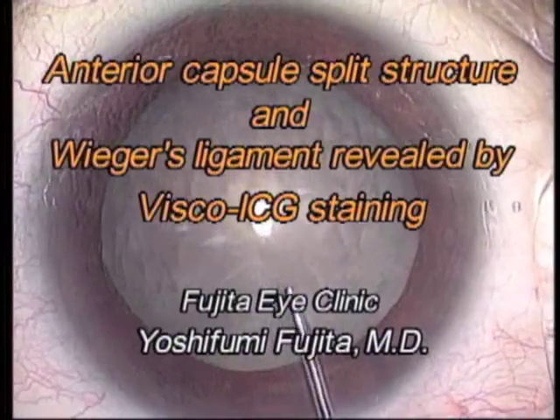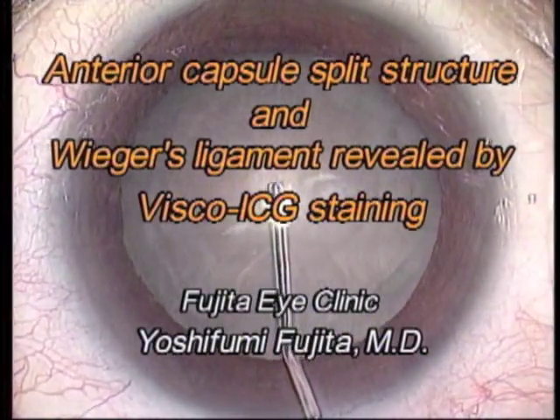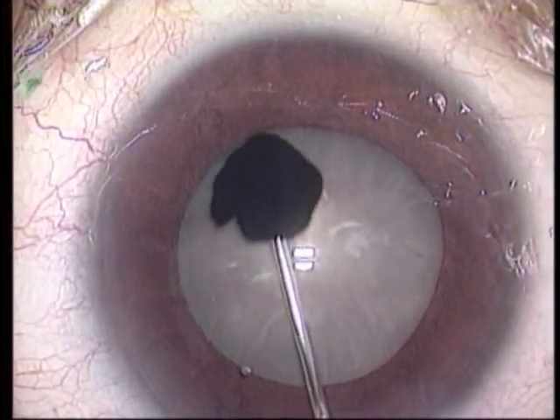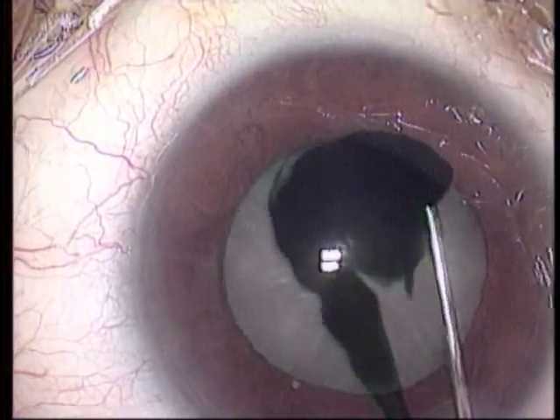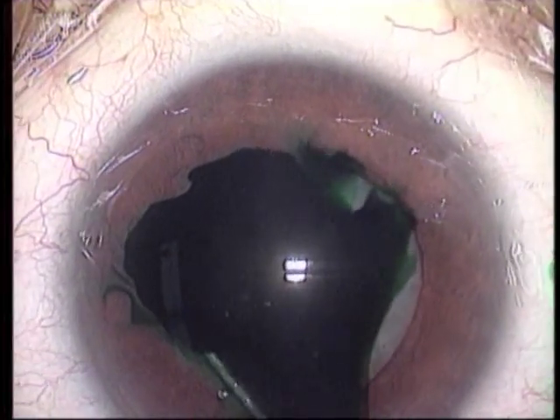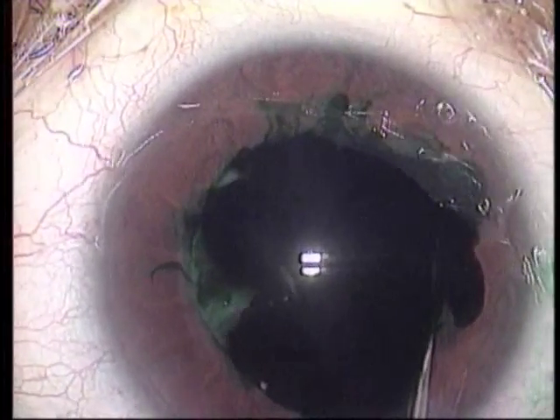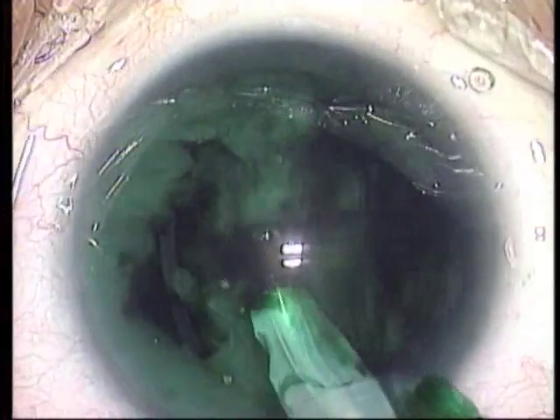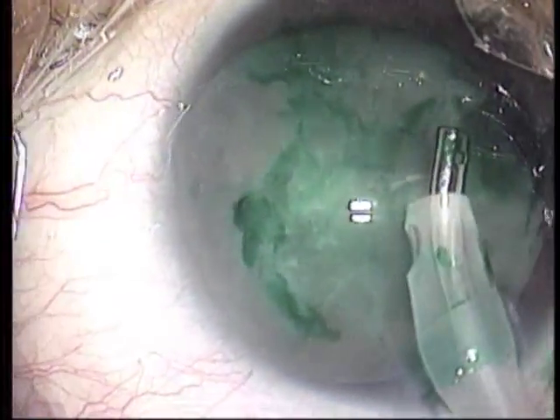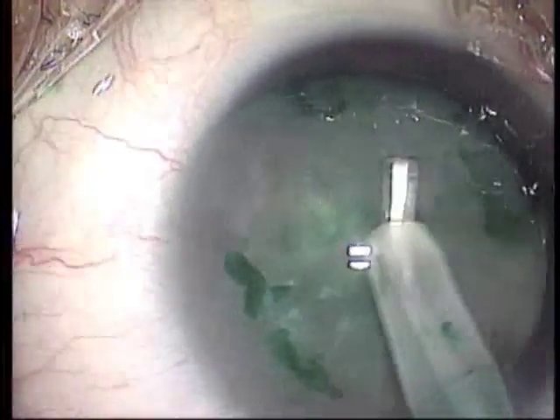Indocyanine green (ICG) is very useful for staining the anterior capsule in the case of a white cataract. With this material, we succeeded in obtaining two valuable anterior segment anatomical structure images: one is an anterior capsule split structure, and the other is Wieger's ligament. Dr. Takayuki Akahoshi introduced ICG mixed with sodium hyaluronate in 2000. Visco-ICG increases the ease of capsulorrhexis in a white cataract by painting the anterior capsule.